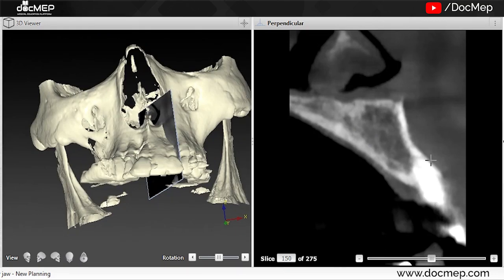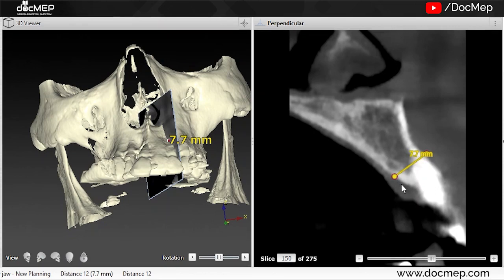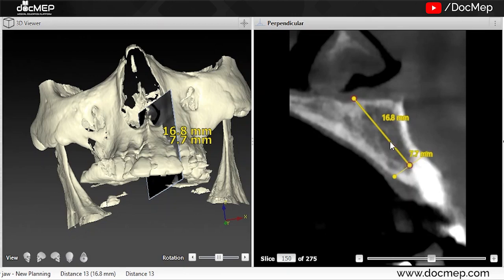For example, suppose we planned to do osteoplasty till this level. After removing this tooth, suppose we do osteoplasty at this level and you have a 7.7 millimeter width available and the length till the nasal floor is 16.8 millimeter. Now, if you are planning an implant of diameter 4 millimeter, then you do not have to do osteotomy more than 2.5 or maximum up to 3 millimeter diameter. Because after 3 millimeter osteotomy, you can directly place an implant of diameter 4 millimeter and that implant will compress the bone all around, anchor in this very good bone, and you will get fantastic stability. All these things are possible if you have a longer implant of diameter 4 millimeter.